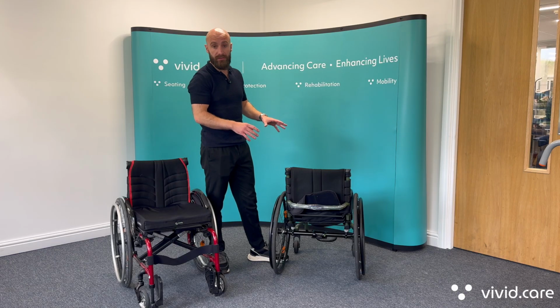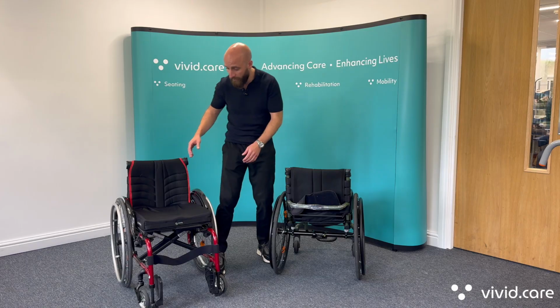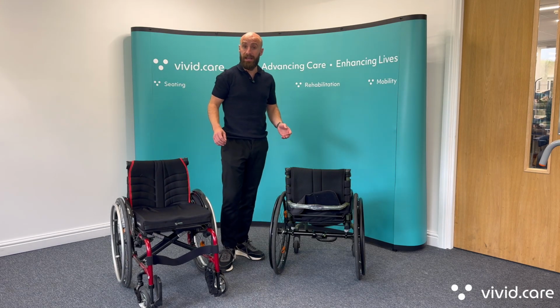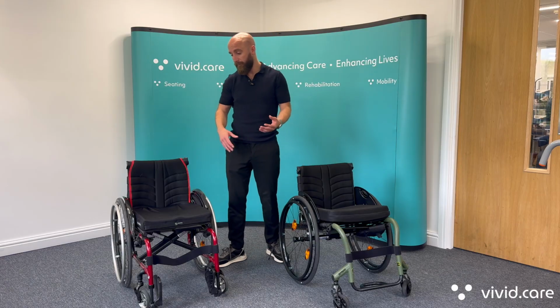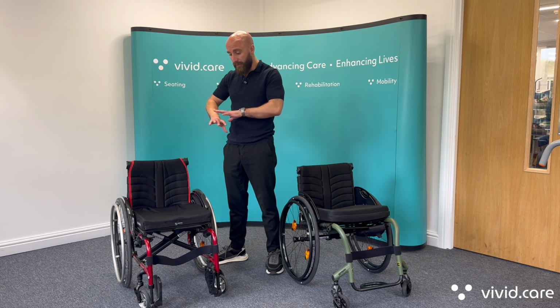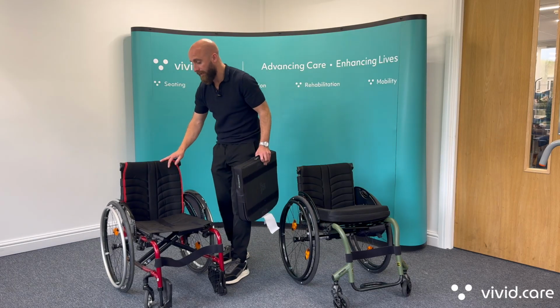And the biggest advantage with the rigid, of course, is when you actually propel the chair, all of the energy from your push goes into pushing the chair. Whereas with a folding chair, because you've got a certain amount of flex in the frame, you do lose a little bit of energy. So I tend to find people propel rigid chairs much easier. And when it comes to folding, folding chairs have moved on a lot in time. When you push to lock them out in the middle, they do tend to be a lot more rigid than some of the older chairs on the market.